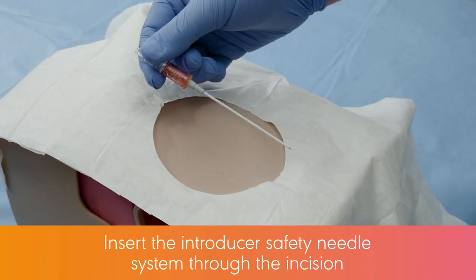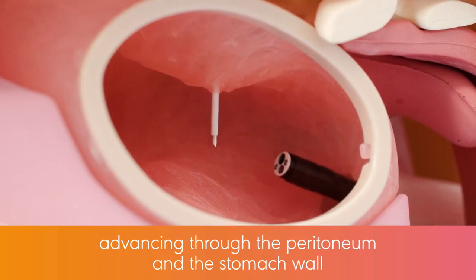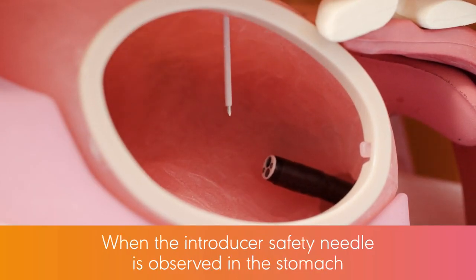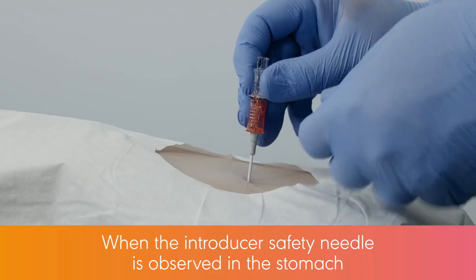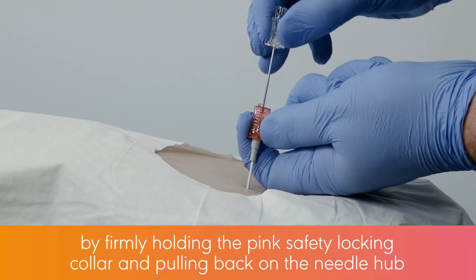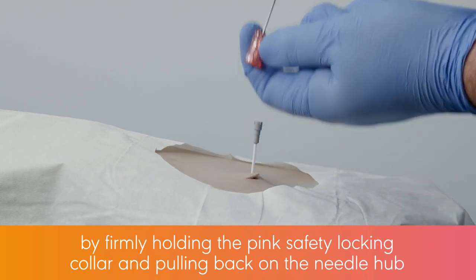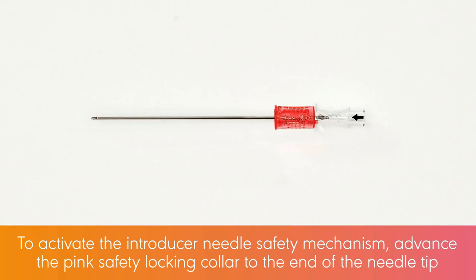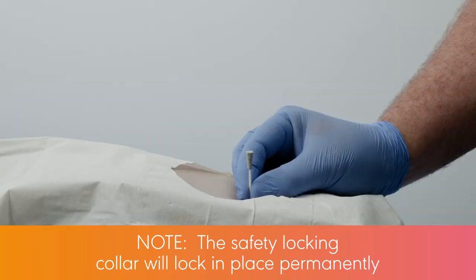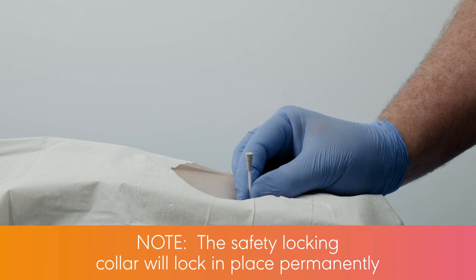Insert the introducer safety needle system through the incision, advancing through the peritoneum and the stomach wall. When the introducer safety needle is observed in the stomach, remove the introducer needle from the introducer cannula by firmly holding the pink safety locking collar and pulling back on the needle hub. To activate the introducer needle's safety mechanism, advance the pink safety locking collar to the end of the needle tip. Note, the safety locking collar will lock in place permanently.